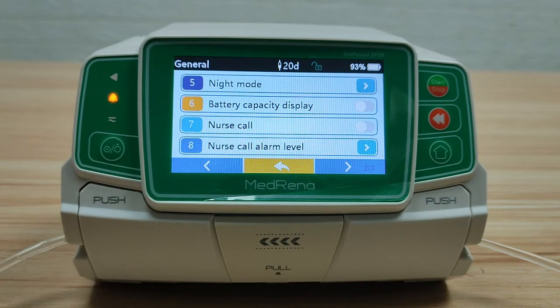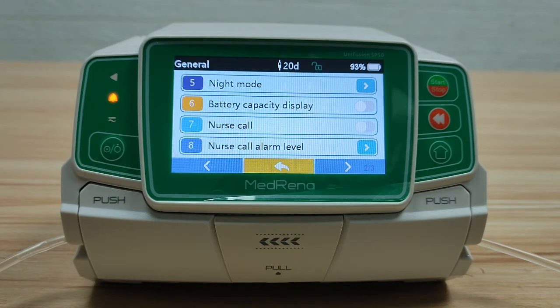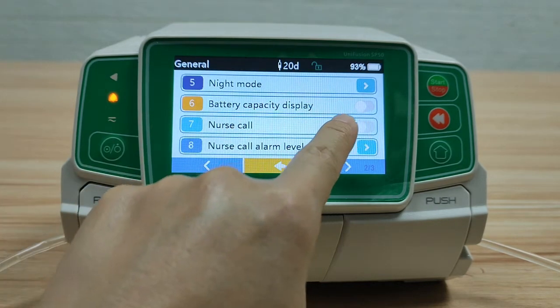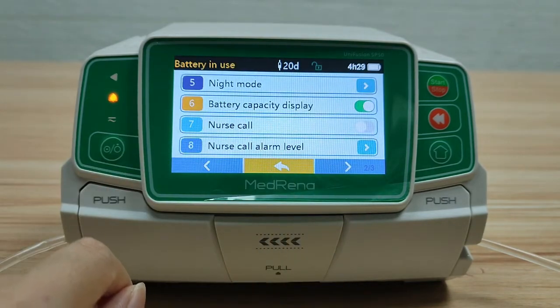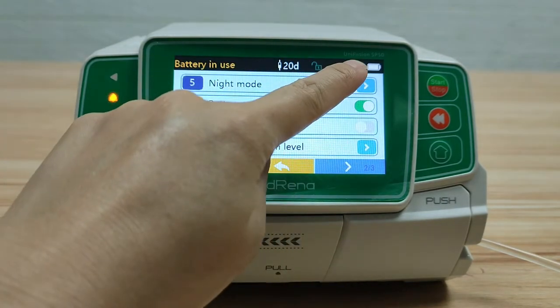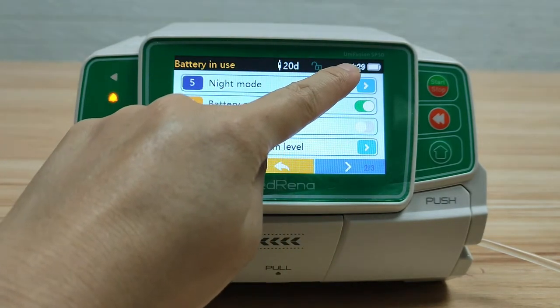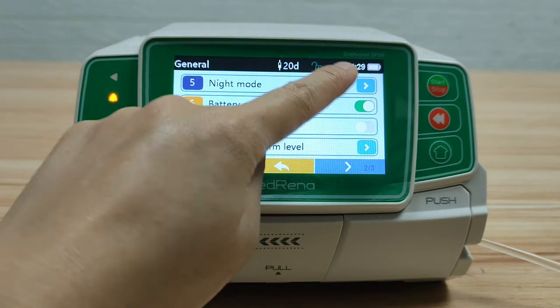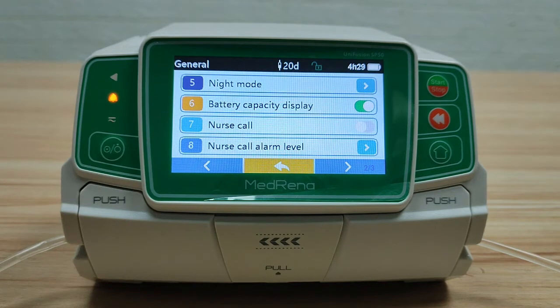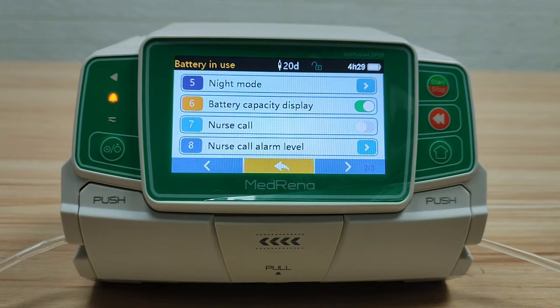Battery capacity display: by selecting it on, the screen bar will show the remaining time that the pump can operate based on current battery power supply.